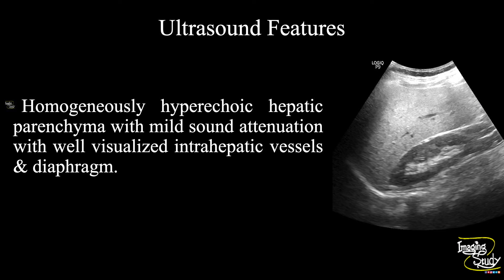In summary, the hepatic parenchyma is homogeneously hyperechoic with mild sound attenuation. The intrahepatic vessels and diaphragm are well visualized. These features conclude this as a case of mild hepatic steatosis.